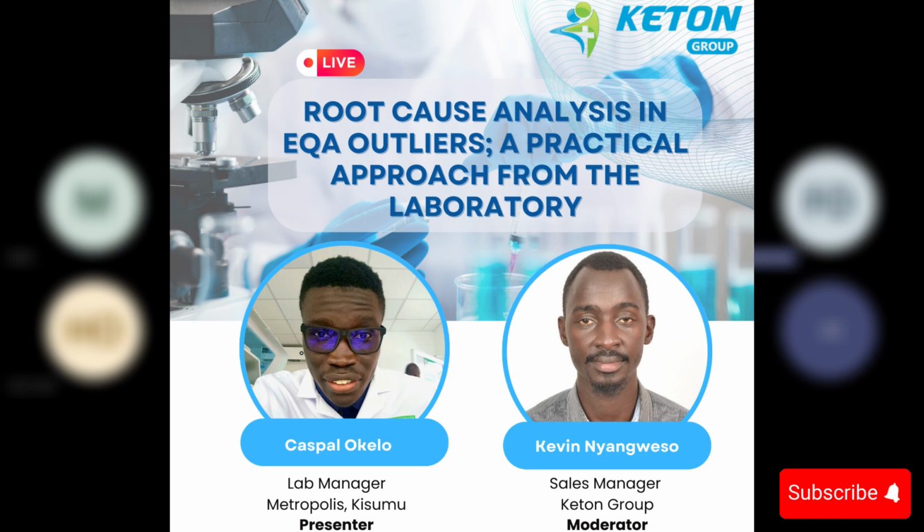Ideally, it's always required to use a fixed mean, because it will give you a true picture of the bias, if there's a bias, as compared to the moving mean. Sometimes you might overlook issues regarding the warnings as per the Westgard rule. So the recommendation is to use a fixed mean.